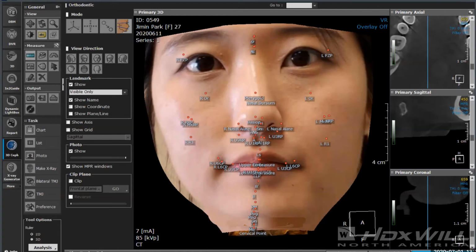Certainly, I think the best way to answer that is you probably have to reach out to Cybermed and see if the software is available independently. I don't know exactly for sure. It's not that I'm avoiding the question. It's that I just don't know exactly whether they provide it or not, or what the cost is. But Cybermed is the manufacturer of On-Demand 3D, and from that point forward, you can ask them about that. I have a feeling that they probably sell it as a standalone item.